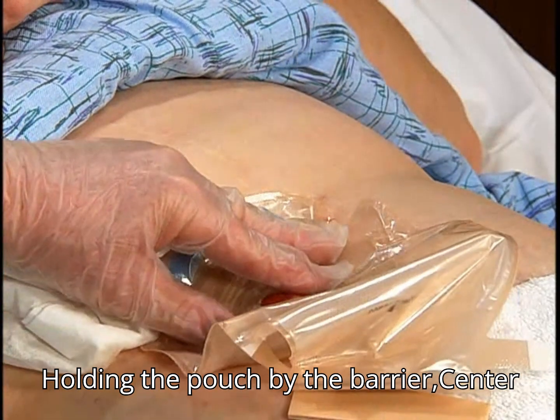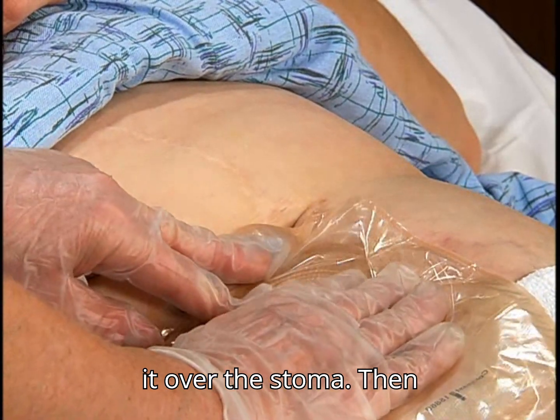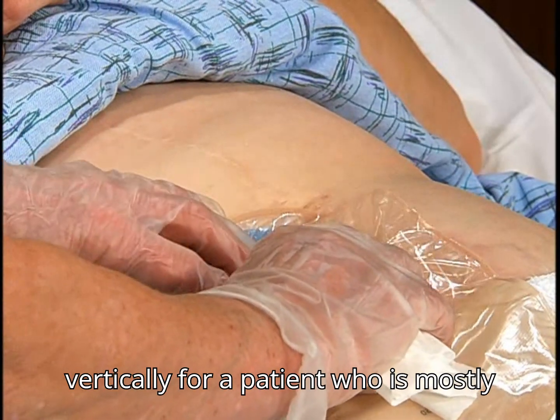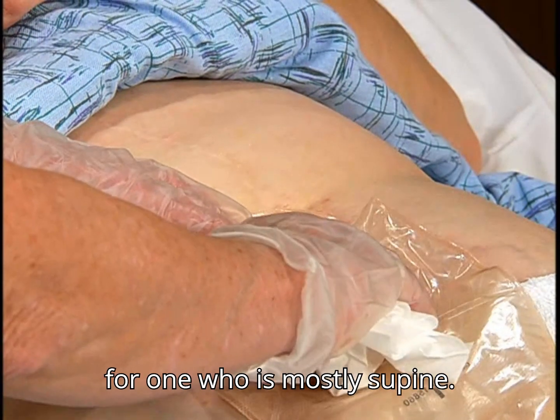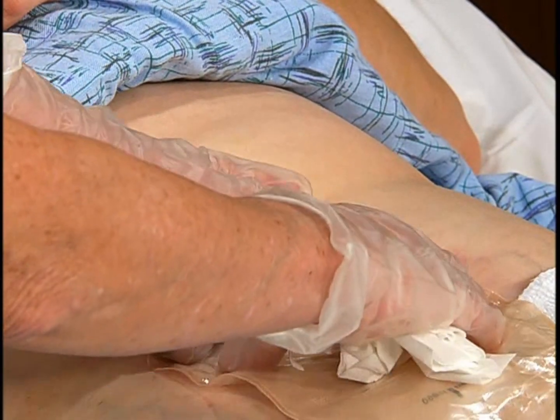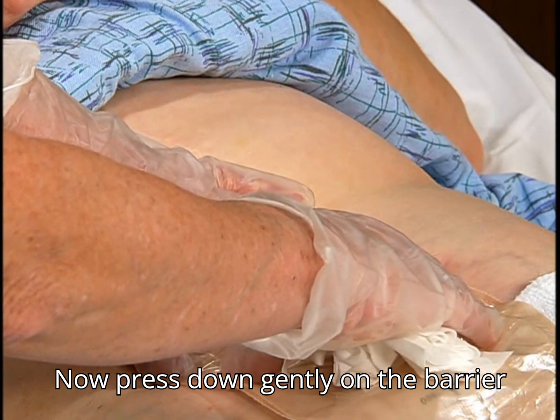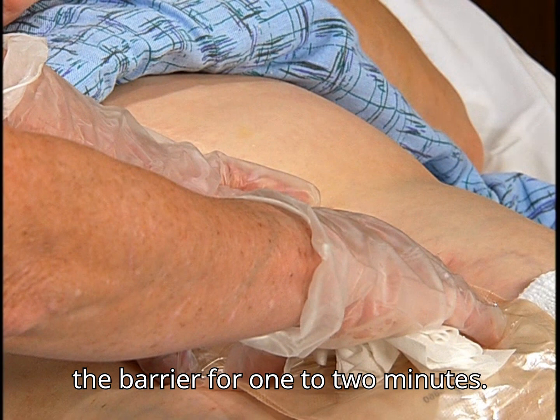Holding the pouch by the barrier, center it over the stoma. Then anchor the pouch on the stoma — vertically for a patient who is mostly ambulatory, or horizontally for one who is mostly supine. Now press down gently on the barrier and apply gentle finger pressure around the barrier for one to two minutes.